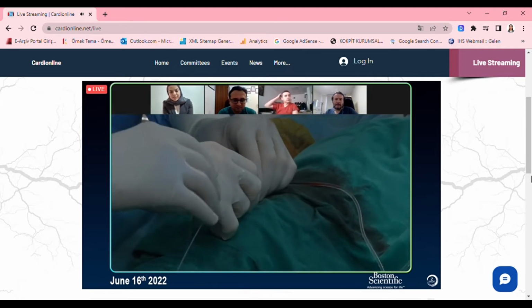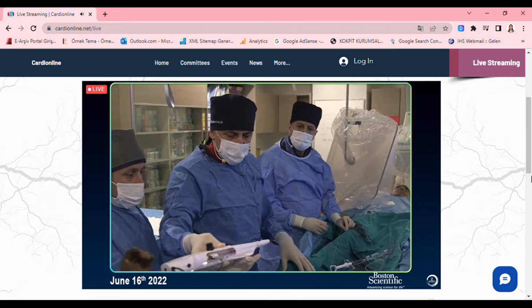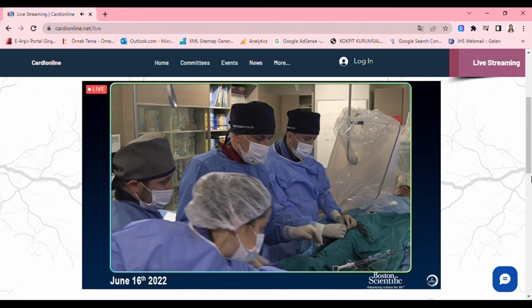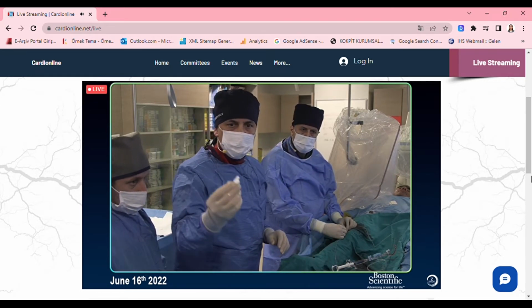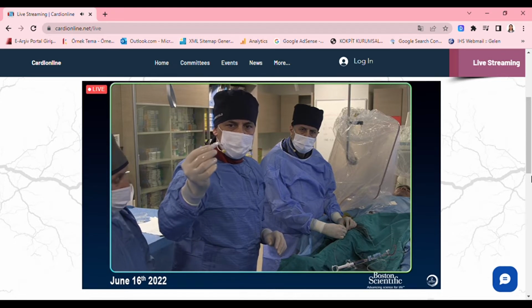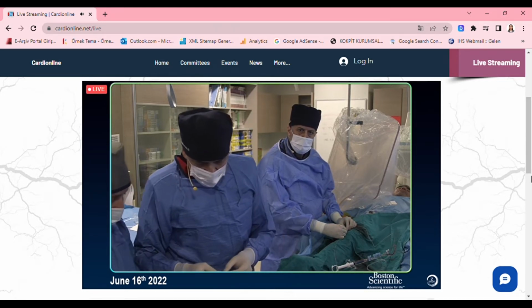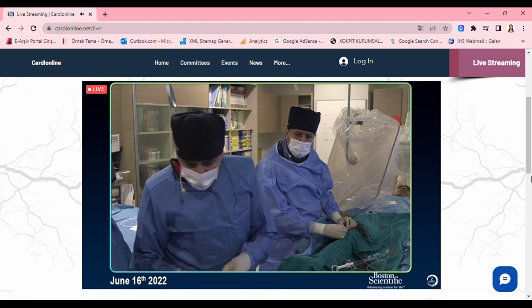Okay, a little bit more. Yes. Okay, here. We will do some control. And now I insert my burr. So, where is the wire clip? This wire clip is a very important tool. Before testing, the wire clip should be set at the end of the wire. Otherwise, when we do the test, the wire will kink.